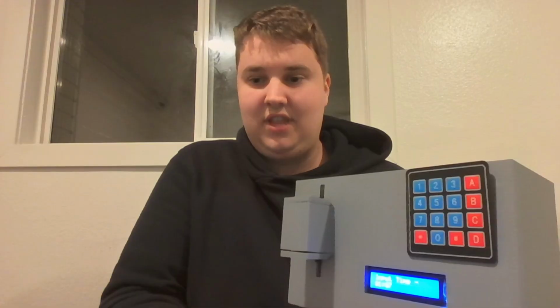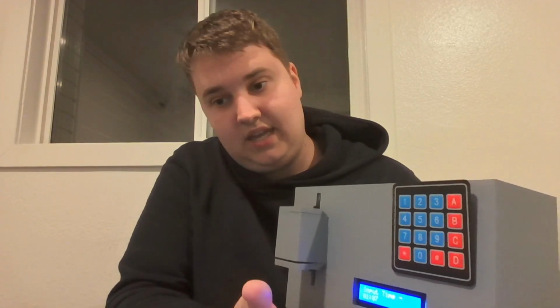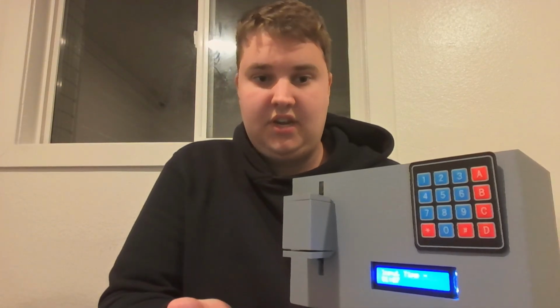I'm going to input 0, 7. Now it is waiting for 1:07 to dispense. So I'm going to hold out my hand in preparation for that. I stored those values separately because the real-time clock has them as separate values, and then I just put them together in the print statement so that it appears as a full time there.